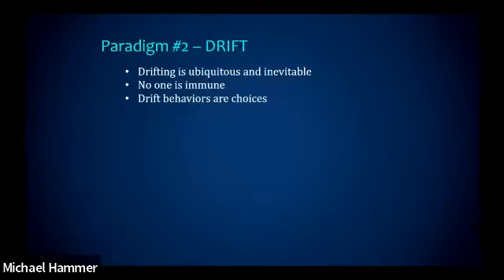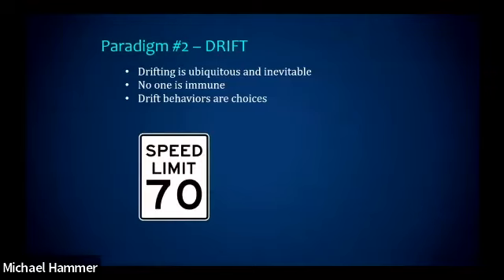The second paradigm is that we drift. So we start with being diligent and knowing what we're doing. I'm a new grad. I read all the instructions. We got a new product, read the owner manual. I've got a new patient. I know this chart inside and out. And then we drift because we get busy. So drift is inevitable and unavoidable. No one's immune. However, when we drift, it's a choice. Human error is not a choice. Drift is a choice. And we're going to go through some examples as we wrap things up.